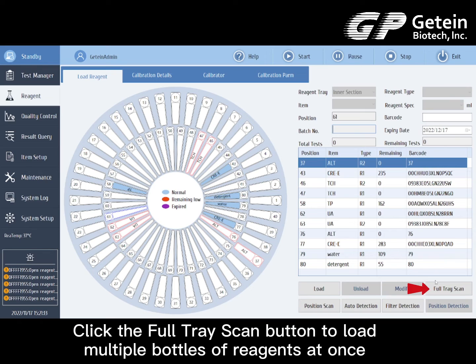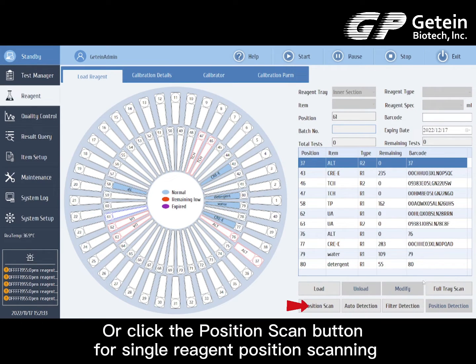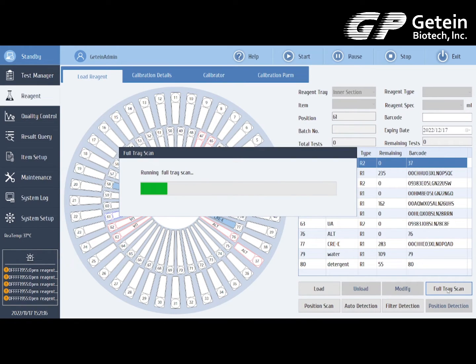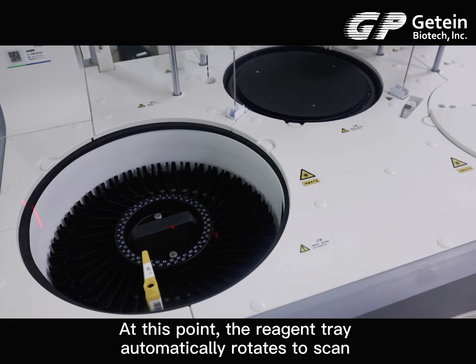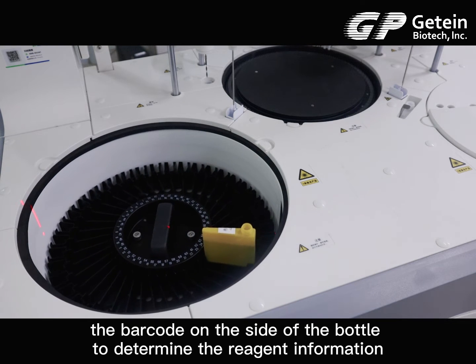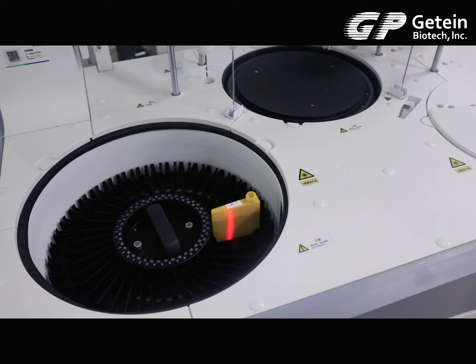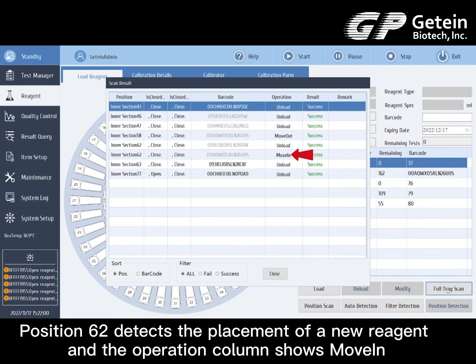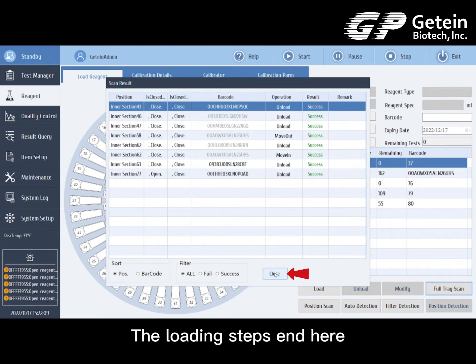Click the full tray scan button to load multiple bottles of reagents at once, or click the position scan button for single reagent position scanning. The reagent tray automatically rotates to scan the barcode on the side of the bottle to determine the reagent information. Position 62 detects the placement of a new reagent and the operation column shows 'move in'. The loading steps end here.